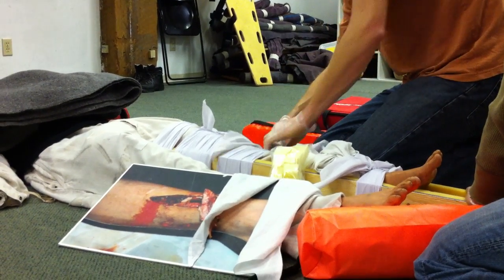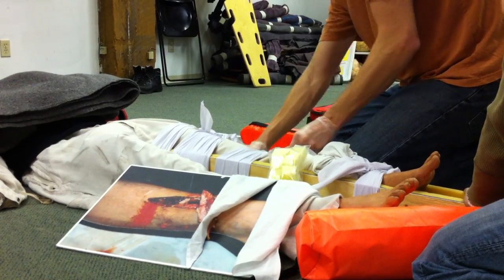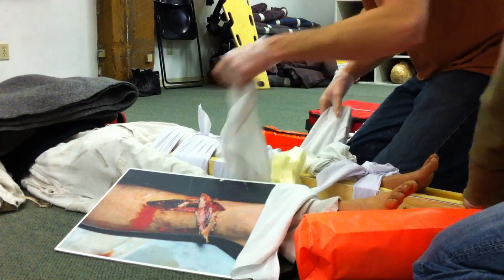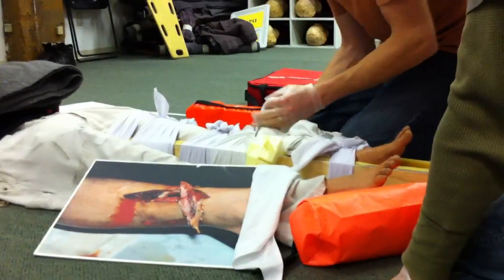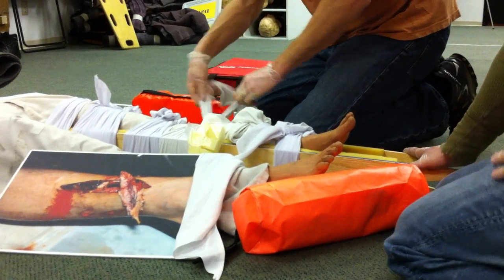Is it tough to do when somebody's screaming at you, Dave? Yeah, it's brutal. And like I say, you're being super, super careful with all of this, super gentle with your ties. You've got helpers holding everything, and yet you want to crank those nice and secure.